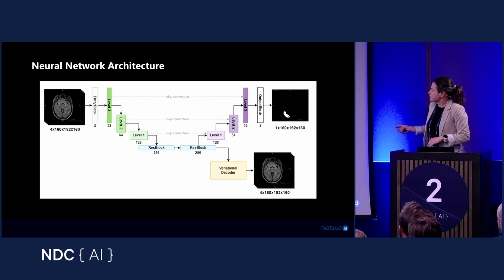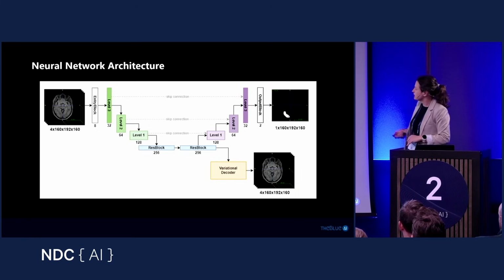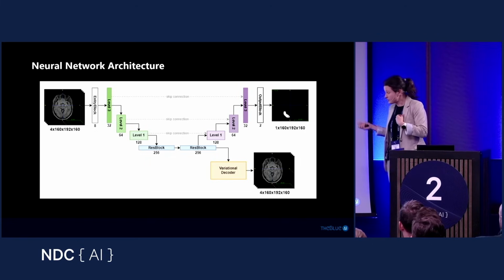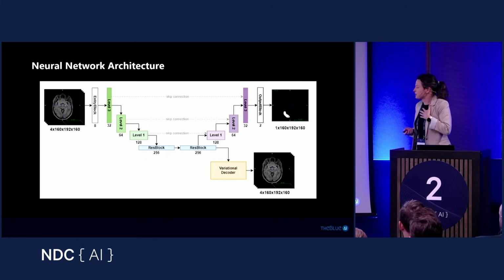And in the decoder part, from this bottleneck, we are trying to recreate either the original image or we are trying to recreate the mask. Like in our case, this is quite a huge FCD present in here. And the idea here is that if we try to compress the data in this bottleneck, we are collecting all of the most important features for our target to be recognized.